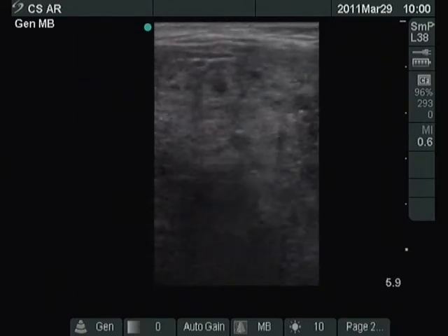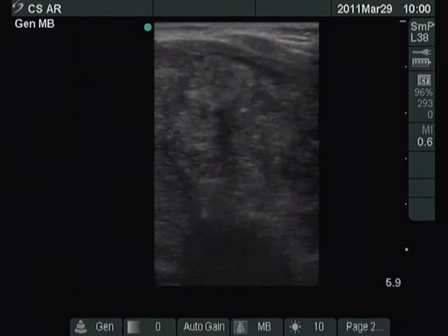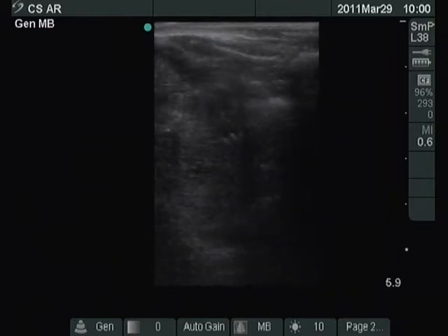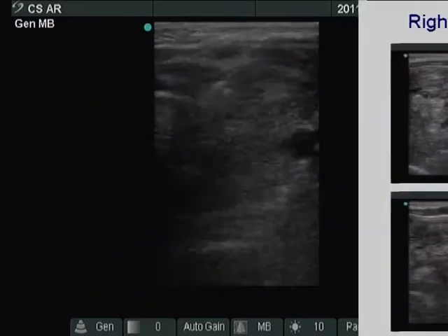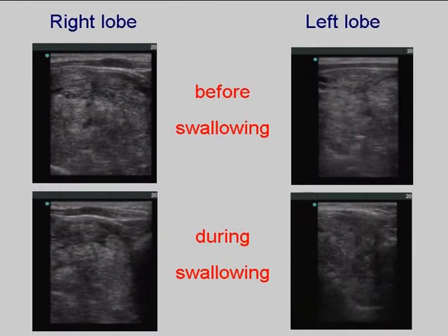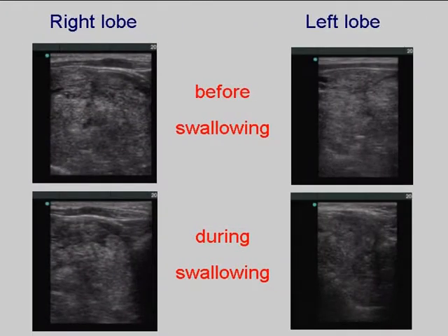The lower pole cannot be visualized not only before but also while swallowing. The lower pole of the right lobe came into sight while the patient swallowed, but that of the left lobe did not.